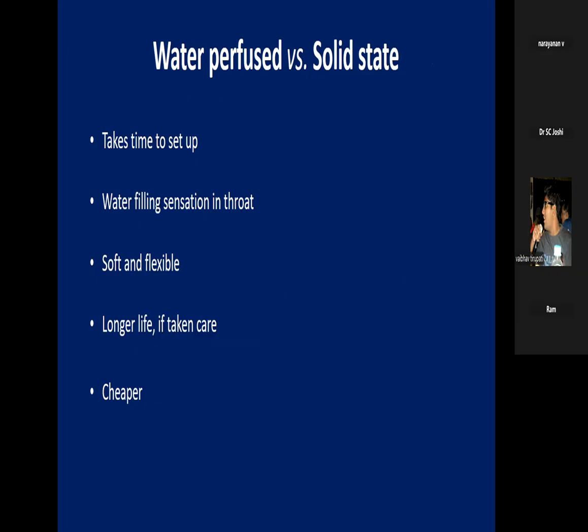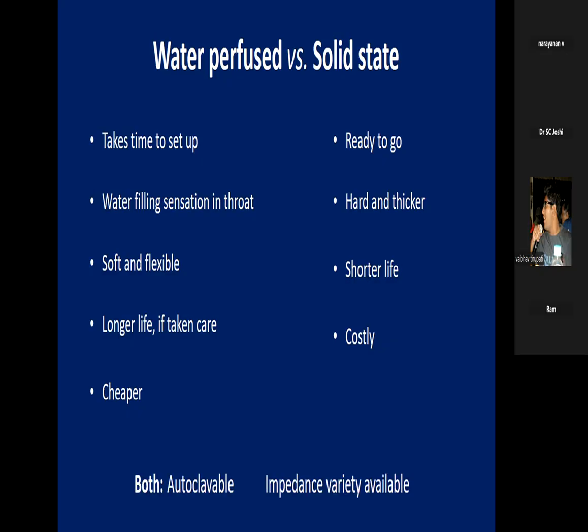if taken care of. And the catheter is cheap. It is not very cheap, but compared to solid state, it is cheaper. Whereas the solid state is ready to go. It's like a plug and play, but it is quite hard and thicker and tends to have a shorter life, and is much costlier compared to the water perfused. However, both are autoclavable and impedance varieties are available with both.